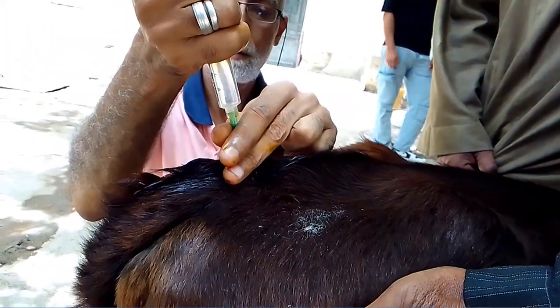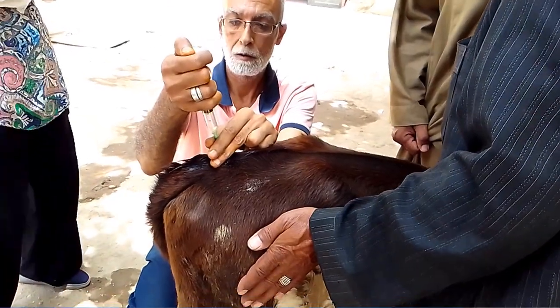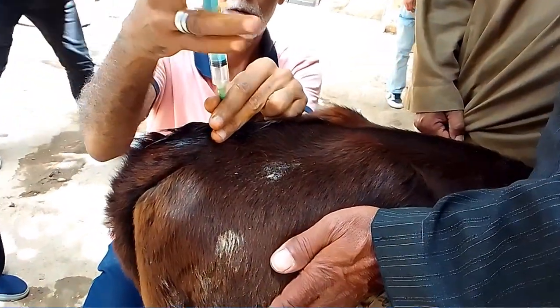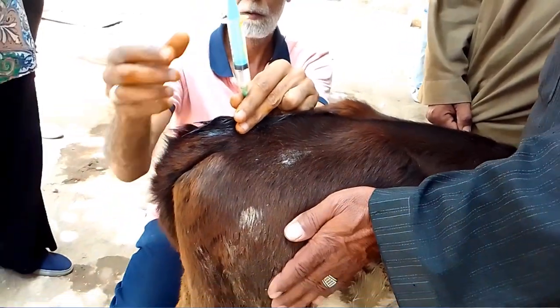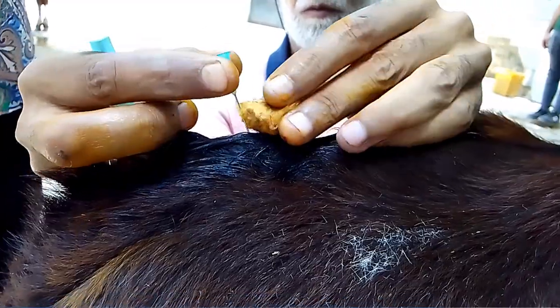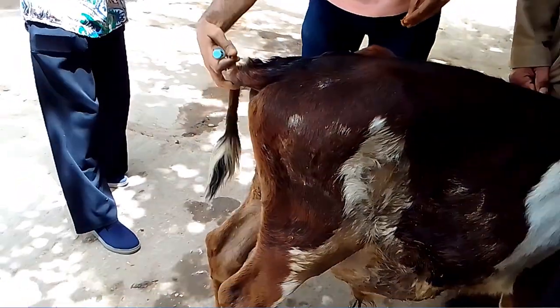Then we inject the analgesic solution. And watch the effect on the caudal half of the animal.